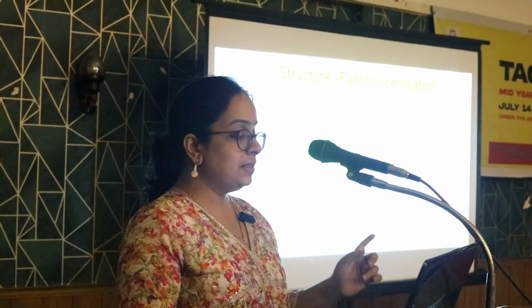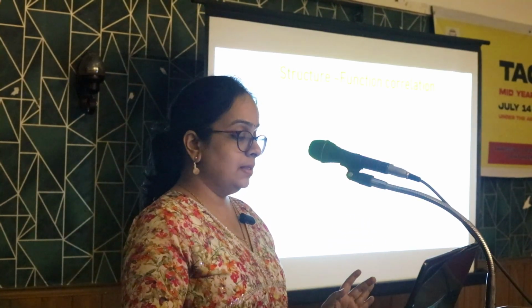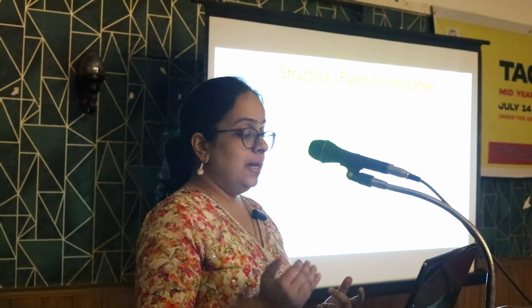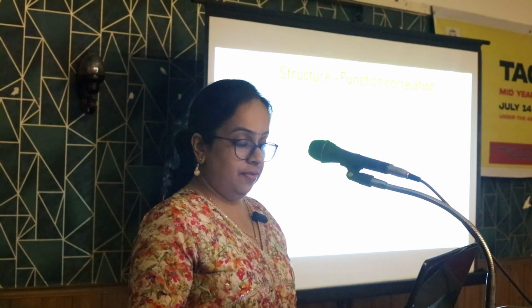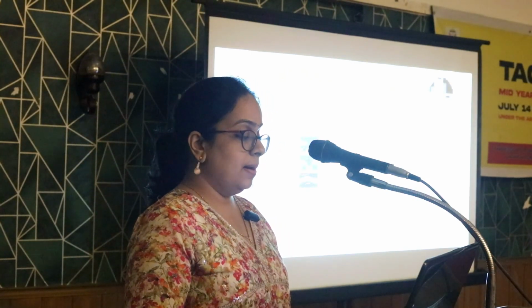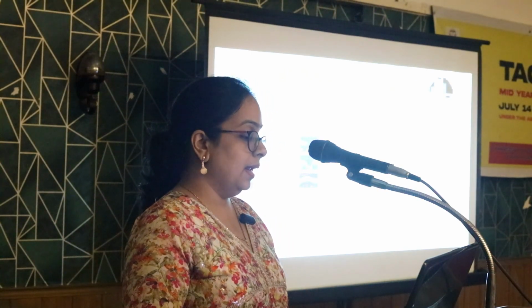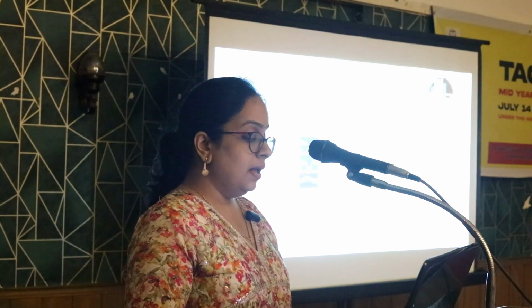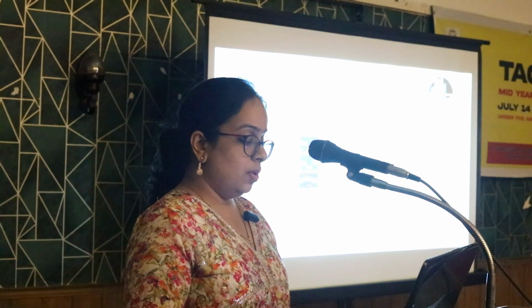And typically in this, 1 and 4 are non-glaucomatous, more suggestive of any neuronal thing, and any change of 3 decibel indicates a 50% reduction in the retinal ganglion cell. So, for example, there is a retinal nerve fiber layer thinning, an RNFL thinning in the inferior part, and basically these two are the areas of thinning.